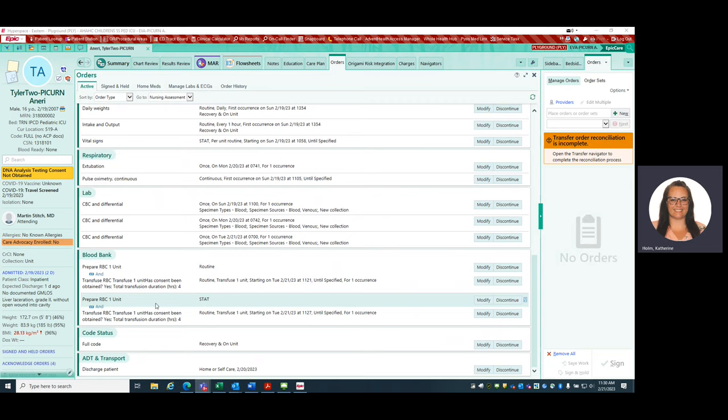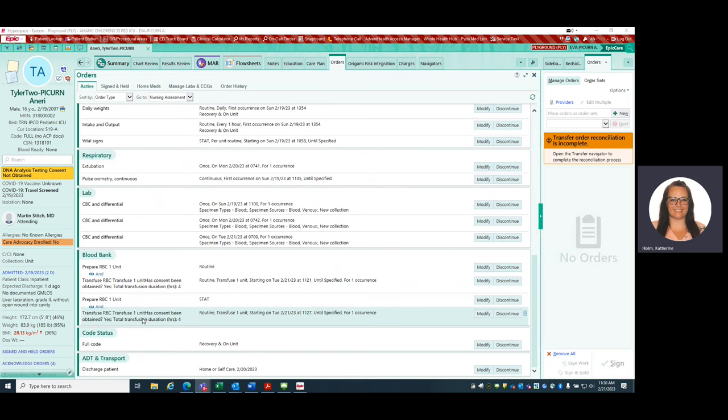We always will see a prepare order, that is for blood bank to know what to prepare for us. But then we always have a transfuse order. The transfuse order is for the clinician to know what to transfuse, how long to transfuse it, and some of those infusion details. We're going to be giving one unit of RBCs, and we're going to transfuse it over four hours. That is our order.